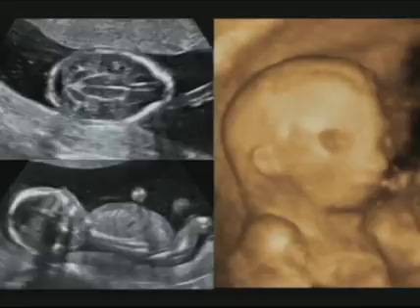The lemon sign and the banana sign are associated with the Arnold-Chiari type 2 malformation, which is in turn associated with an opening in the spine somewhere along the spine. So what this tells me is this fetus has an opening somewhere along the spine. But we don't really know what these fetuses look like.